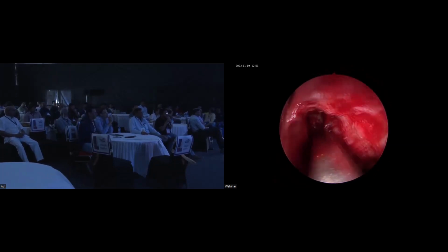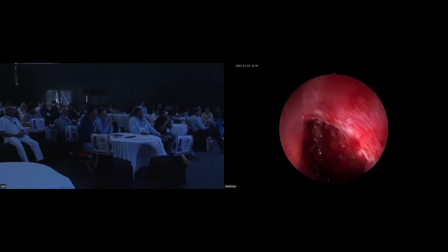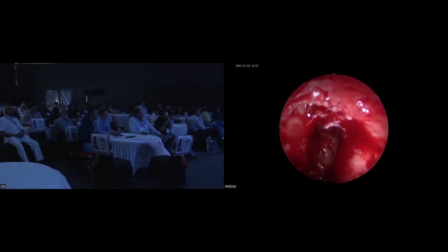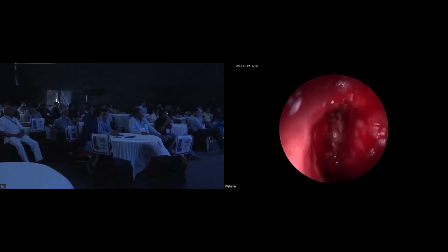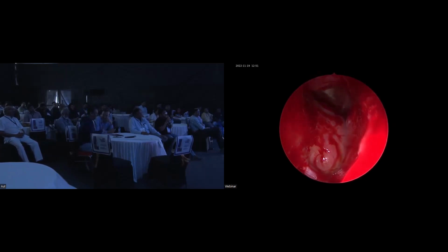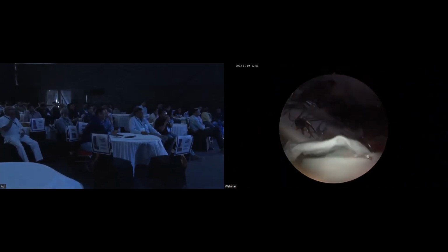Sometimes the suction which goes till that frontal sinus, you can suck out the secretion because it is quite malleable. I can't get you. Your voice comes very cracked. Double curve section, dena. Double curve curate dena. I'm not able to reach there.